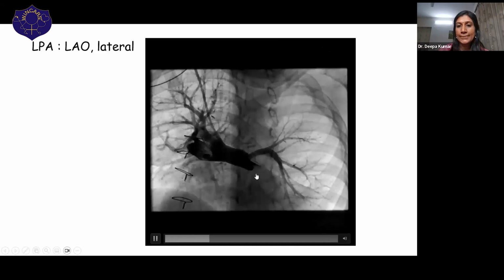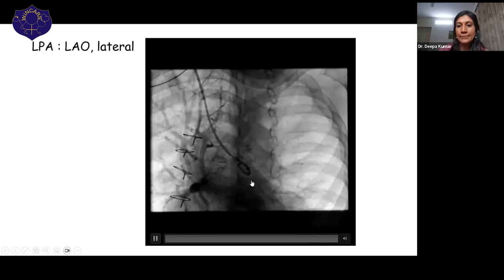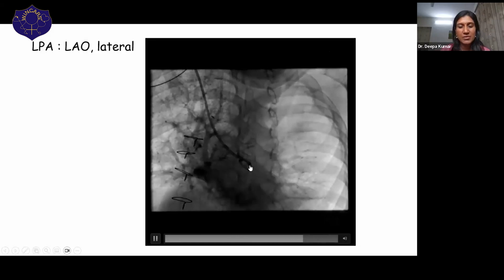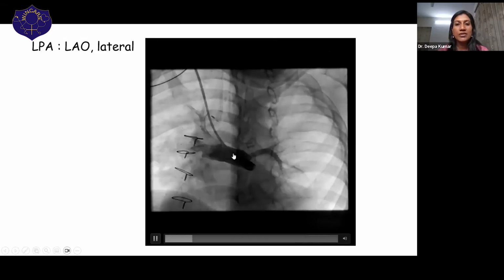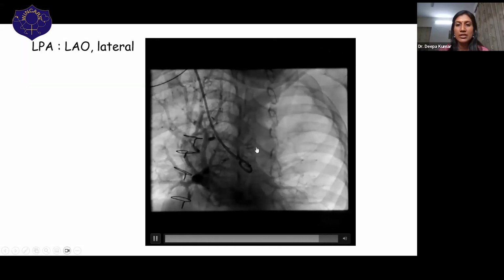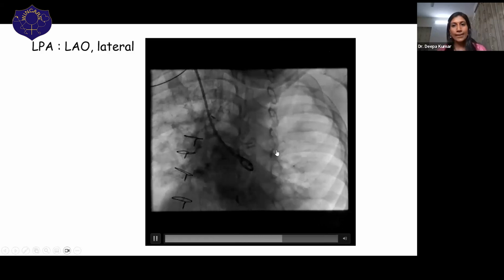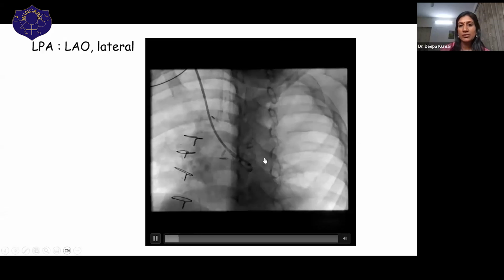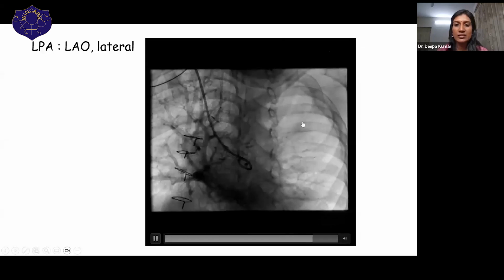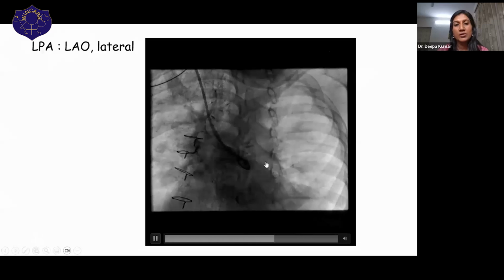You can see some antegrade pulmonary blood flow through the hypoplastic pulmonary valve. If you notice closely, you can see the pulmonary valve moving. You can see some negative clearance, so there must be some antegrade flow. You see a very well-developed, good-sized right pulmonary artery. But what has happened to the left pulmonary artery? The left pulmonary artery is very small. But arborization seems quite decent. You can see all the lobes are having branches, but the branches are small. So this is a hypoplastic left pulmonary artery.